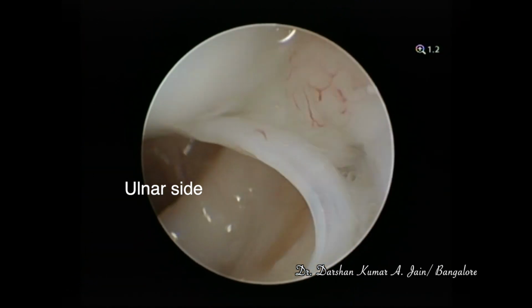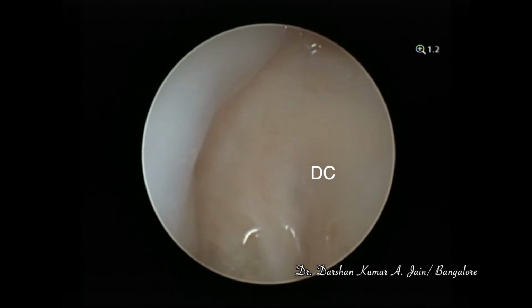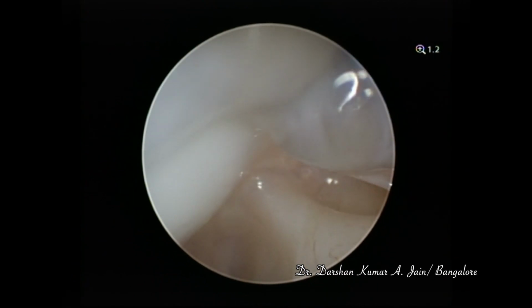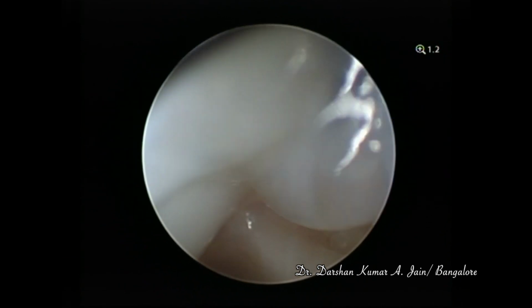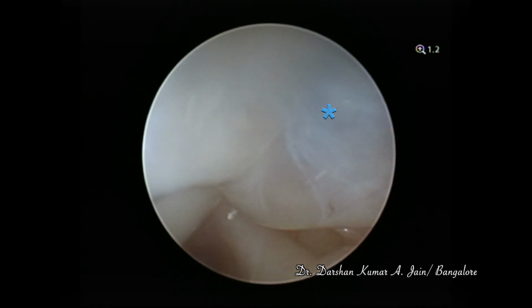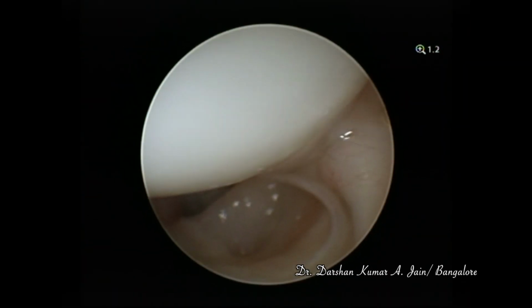I usually prefer a dry arthroscope initially, and only when the area is inaccessible, and if there is a need for joint distension, then we use fluid. We are visualizing from the 1-2 portal. You can see the asterisk there. That's a faint bluish cyst seen on the dorsal capsular reflection. That's the lunate there, and you're seeing the ulnar corner.